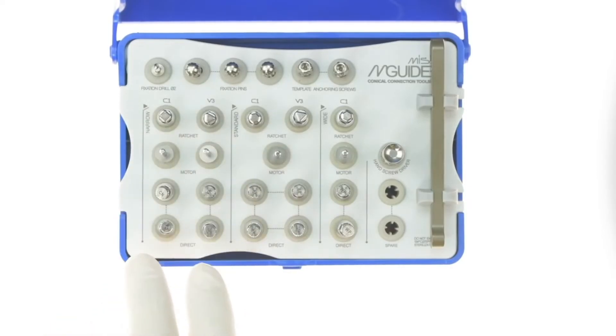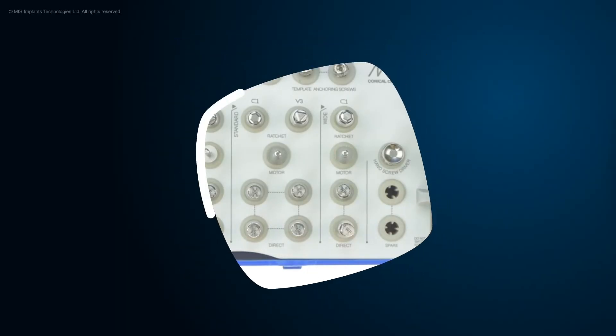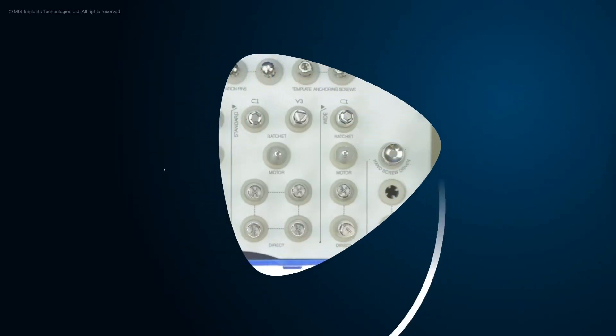When picking an implant insertion tool, make sure to select the correct implant type and platform. MIS — make it simple.